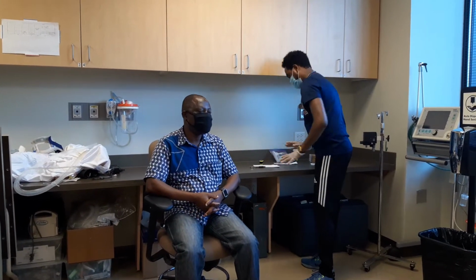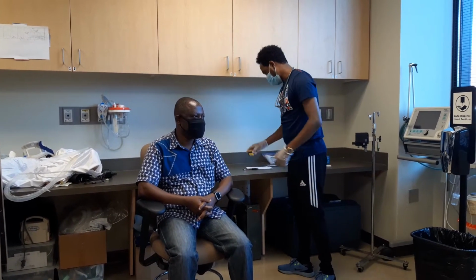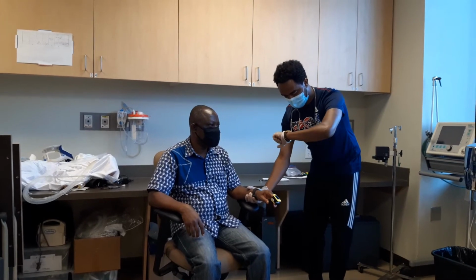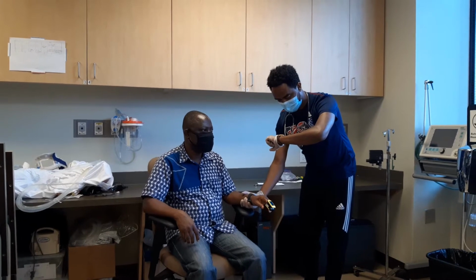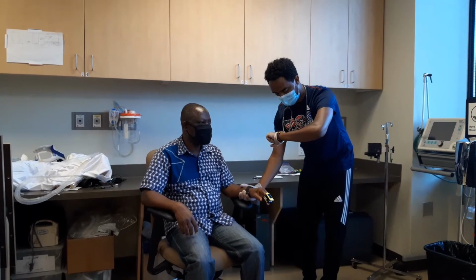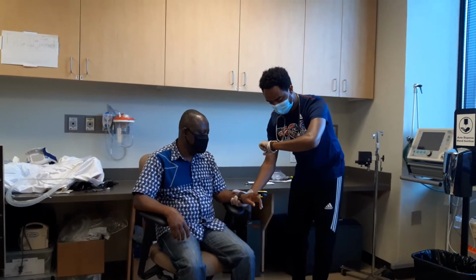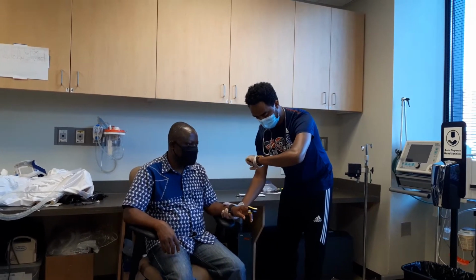Before I start the procedure, I'm going to take your vital signs, and if you have questions, ask me. Okay? Give me your index finger. I'll check your heart rate, and at the same time his pulse oximetry. That's good. It matches.